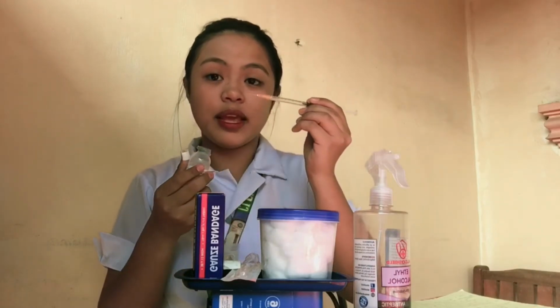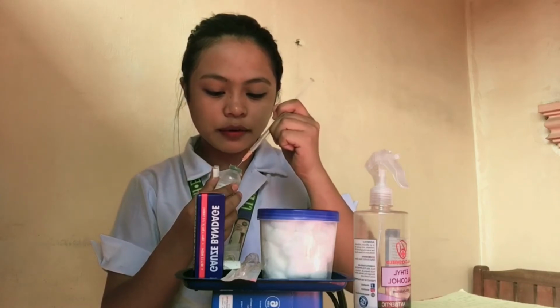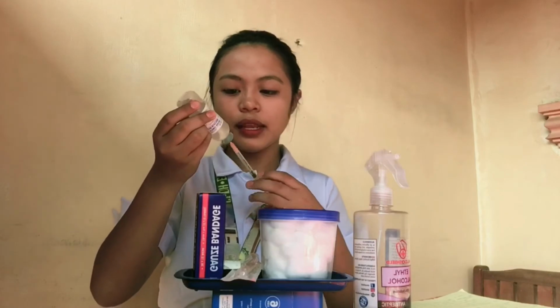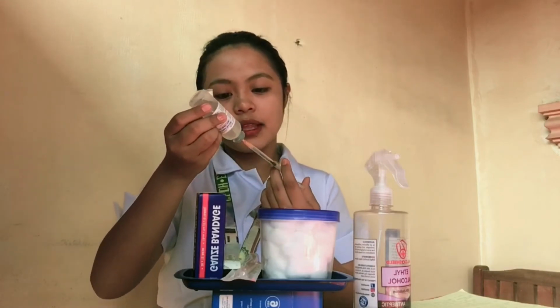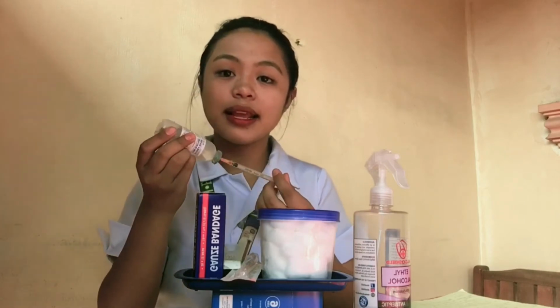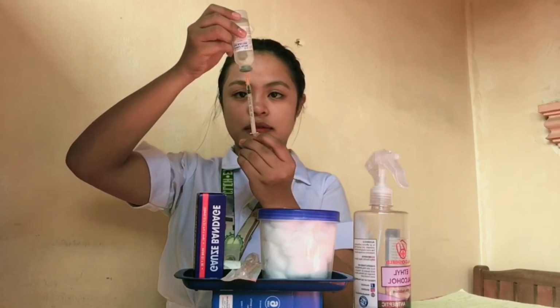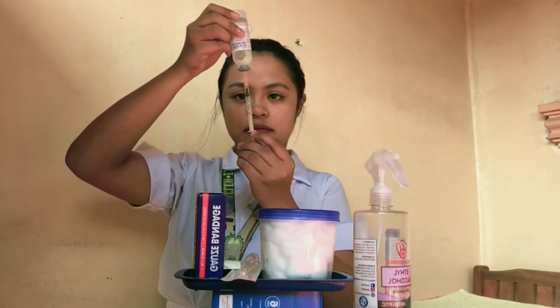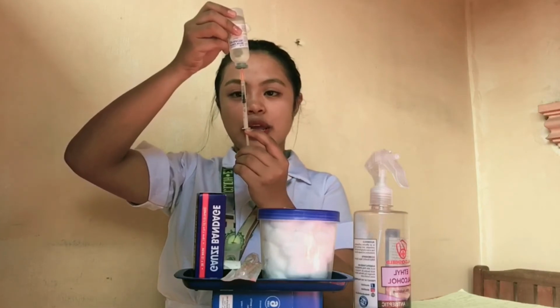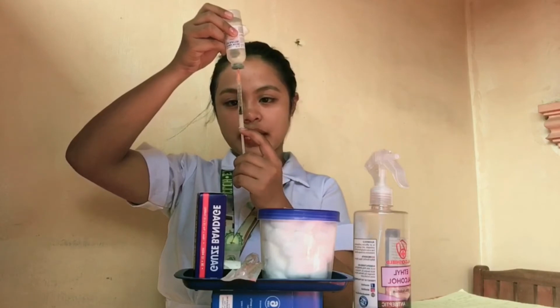So we inject into the center of the sterile water carefully and get at least 1 ml for our skin test. But in getting a medication, don't forget the eye level, for us to measure if we're getting the right amount of medication.